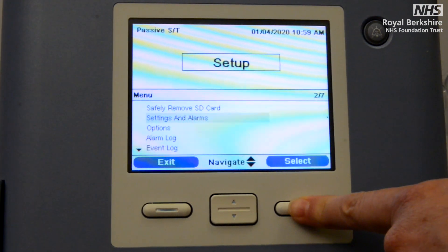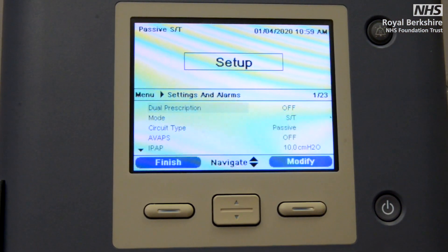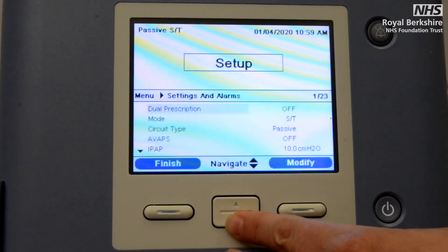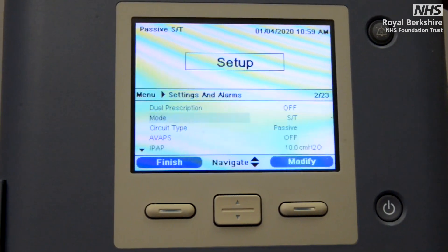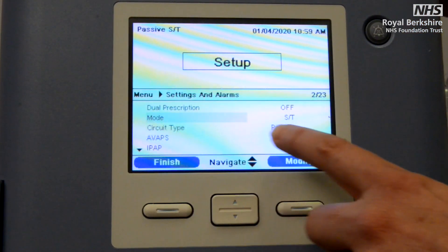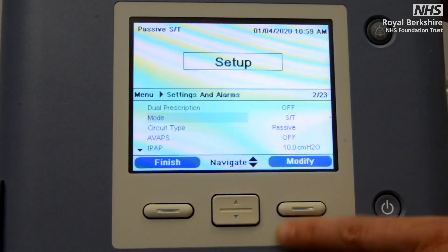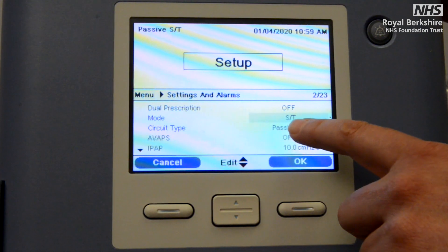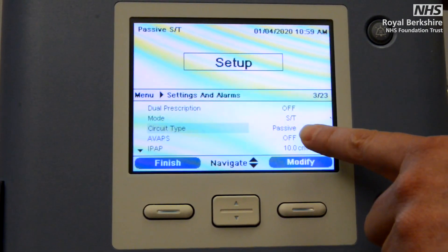I'm using the select button in order to access that. Dual prescription is off, exactly the same as the CPAP. We're now coming down to our mode because we're wanting to set BiPAP or spontaneous timed mode. We now need to make sure that this says ST — if it doesn't, you need to select modify and use your navigation key until you have the ST mode showing.